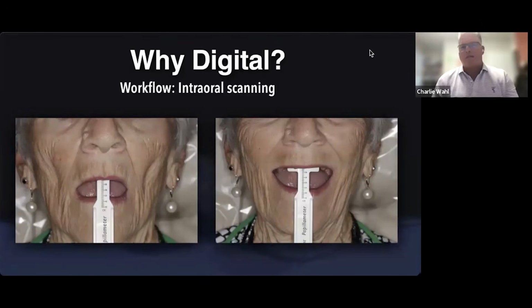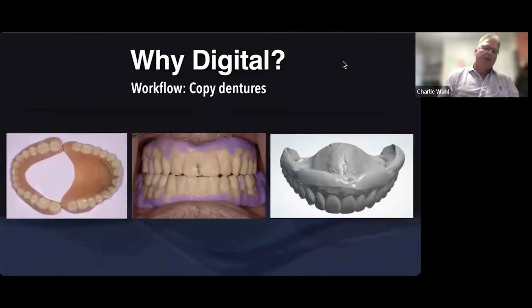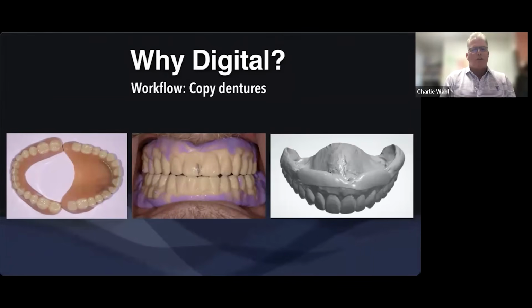I think it's great to make custom trays. I think it's great, with immediate dentures, to get us to the next phase of taking teeth out and putting an immediate denture in. But as a start for my final impressions for digital dentures, I think there's a better way. And this is my favorite. And so the next couple options that we're going to show, the key ingredient is, besides giving us a very accurate tissue impression, we also have reference points, right? We can manipulate this patient into centric relation and have a good stop to help us scan that position, right?